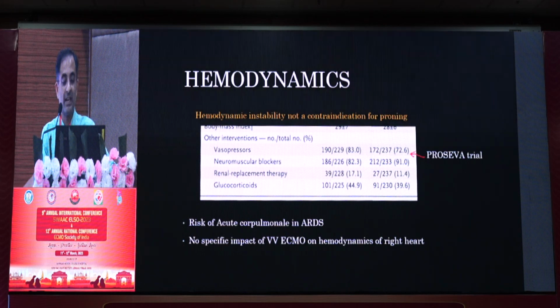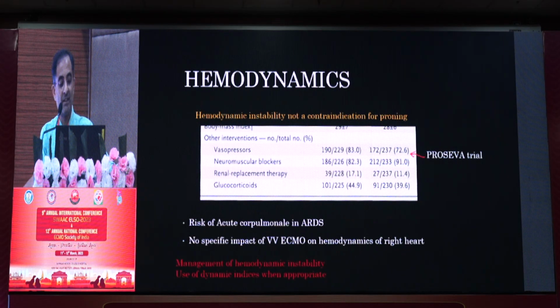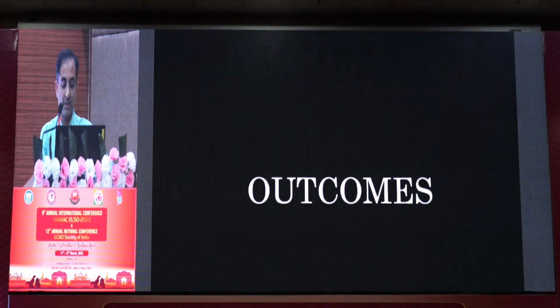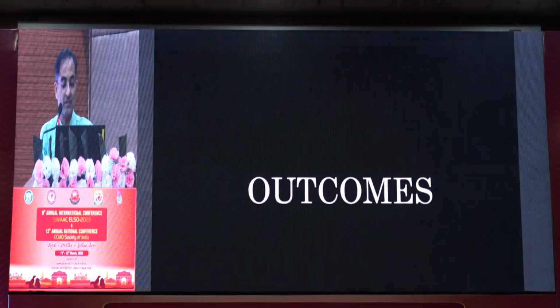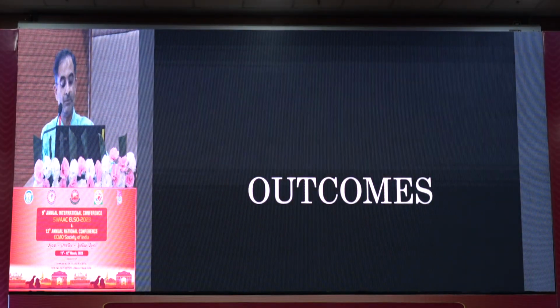There is no significant documented effect of VV ECMO on hemodynamics itself, other than the time, as you know, when we initiate, when there could be a certain amount of hemodynamic instability which can be compensated with adequate fluid management. So management of the hemodynamic instability would be one of the prime necessities to put the patient prone, and the different indices that we use for a conventional ICU patient can be used for measurement of the hemodynamic response or the volume-responsive nature of the hemodynamic instability.